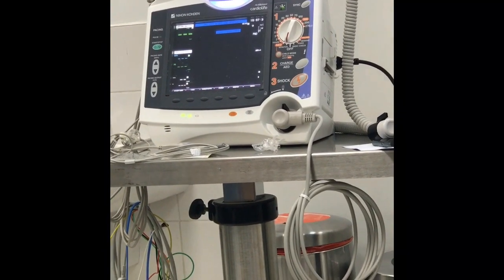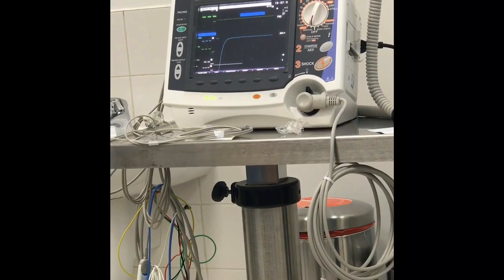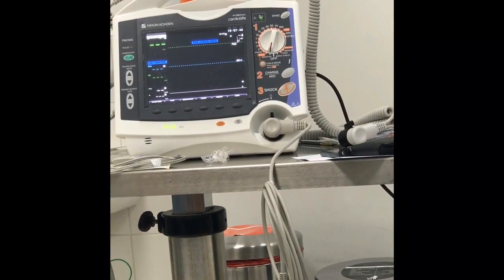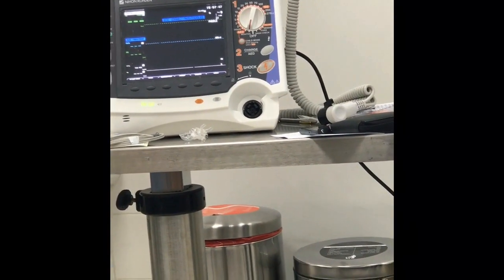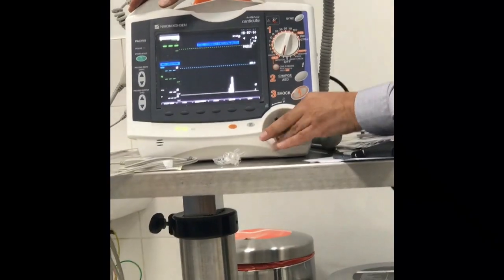Also, there are color-coded parameters. Green for ECG, blue for SpO2, white for ETCO2, and red for IBP. The machine will recognize automatically that there is an IBP. Okay.